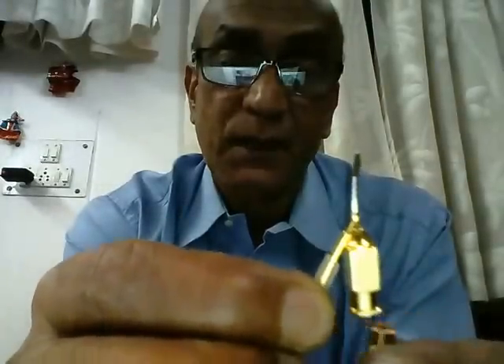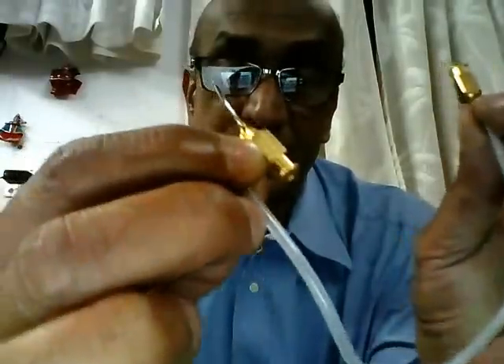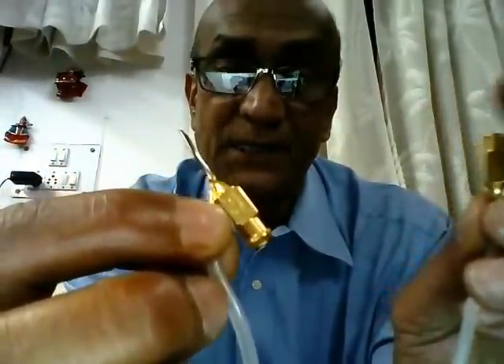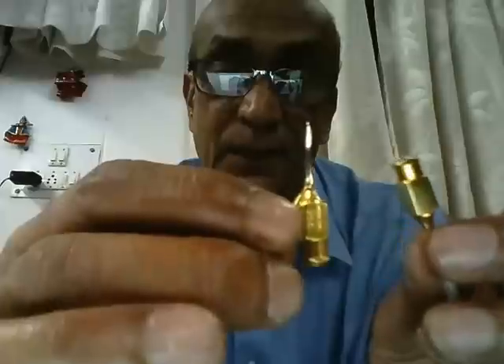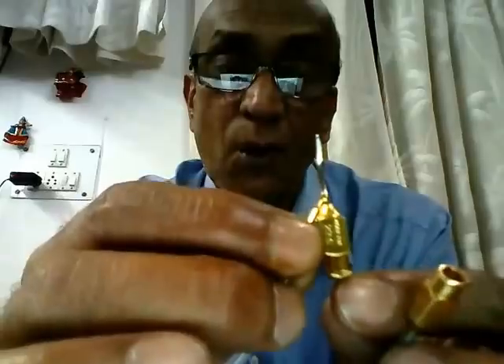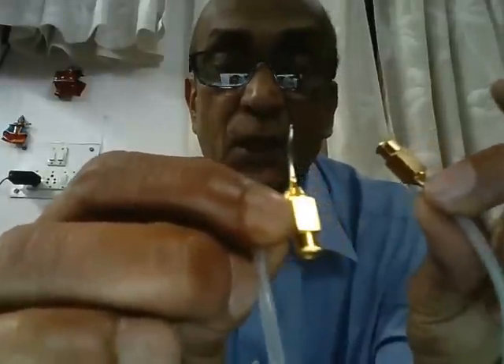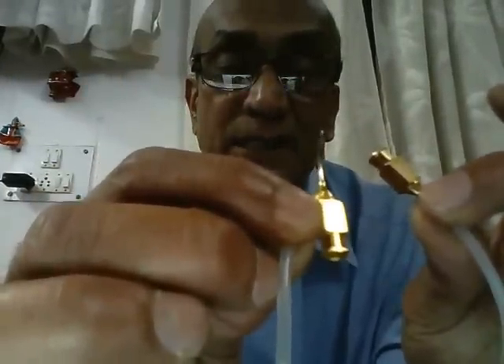In the direct Simcoe, fluid injected through the luer hub comes out through the side port and fills the anterior chamber. The hub attached to the PVC pipe is the aspiration hub — fluid is aspirated through the tip and exits from there. In the reverse Simcoe, the hubs are interchanged, but the ports remain the same: anterior port for aspiration, side port for irrigation. This is the Simcoe two-way irrigation aspiration cannula.